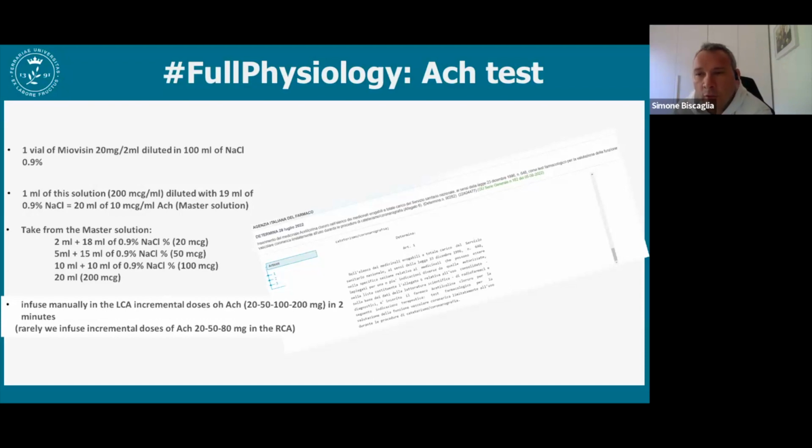The only thing you have to deal with is dealing with the cardiac frequency of the patient, and especially at the 100 steps, so the third one, you have to be careful, and maybe in some cases it may take you 3 minutes instead of one to infuse the drug, because otherwise the patient will have pauses or at least bradycardia. But then you go very, very smoothly. The fact that you have already the catheter and the guide down the vessel is extremely reassuring, at least for me.